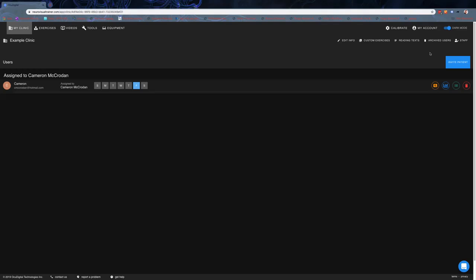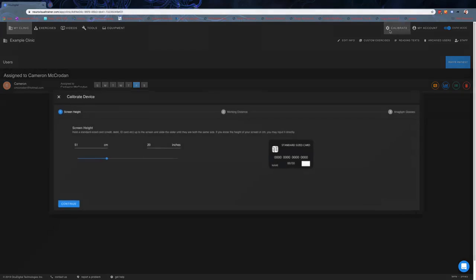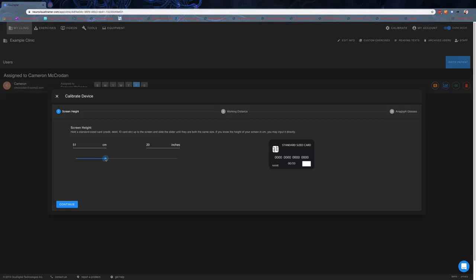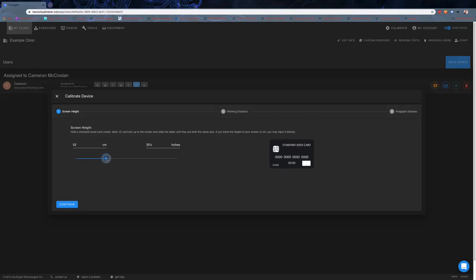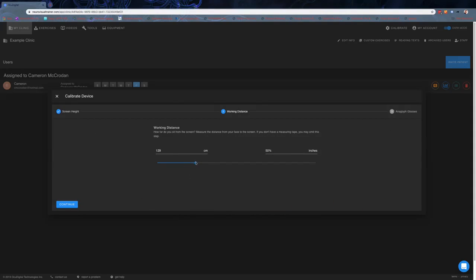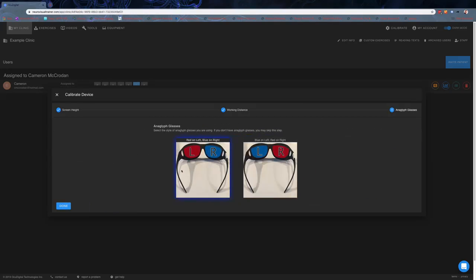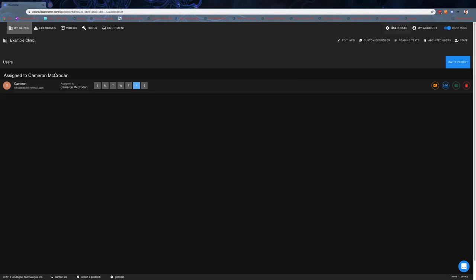The only last thing I can think of that was kind of jumping out at me was the calibrate button. This comes up for patients when you assign Randot or things like that, where they're going to have to calibrate their screen by using the size of a standard credit card, because not everybody has a ruler on hand. You can calibrate the screen, choose the working distance, how far away you're sitting, and whether your anaglyph glasses are red on the left or red on the right. This opens it up to the use of lots of different anaglyph glasses because the purpose of this program was to make something easy and accessible. Don't worry, that happens automatically for patients when they're doing certain activities, but at any given time you can also go up and calibrate as needed.